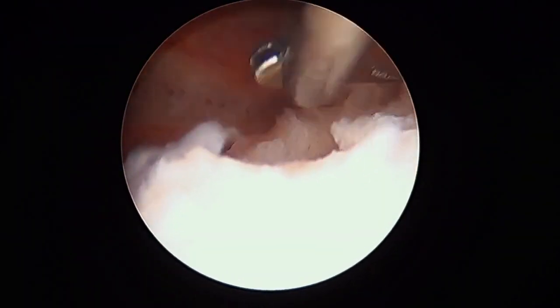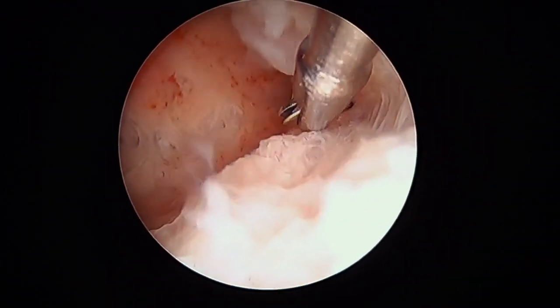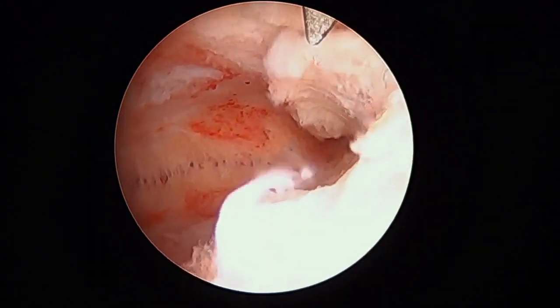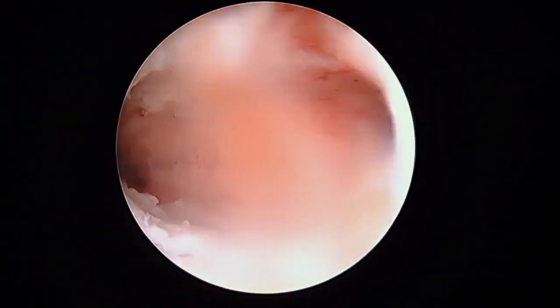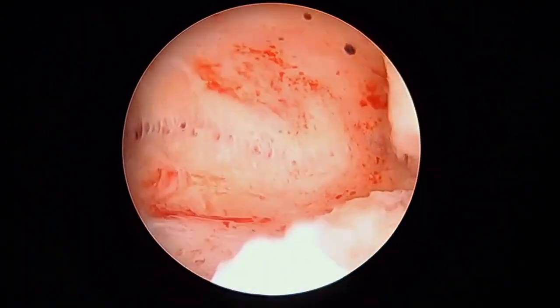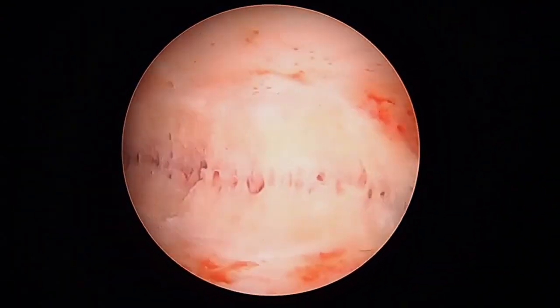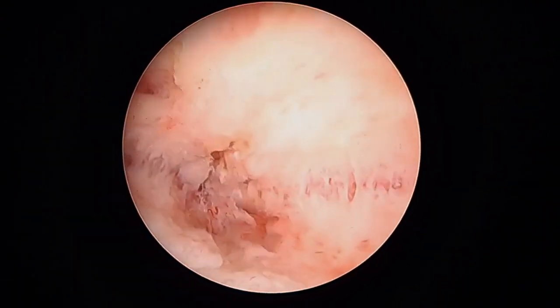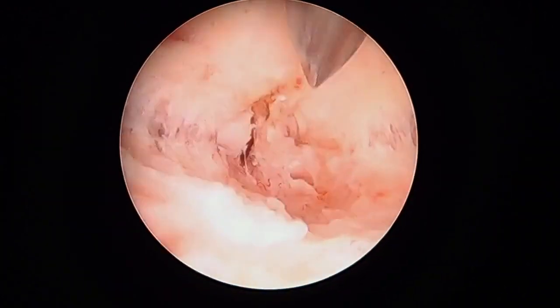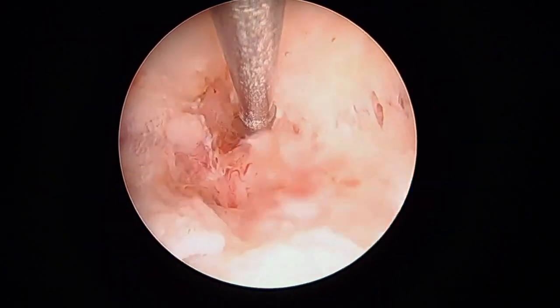Slowly and gradually, we make our way towards the corneum, as can be noted here. At the end of the case, the anatomy of the endometrial cavity is restored with both tubal ostia visualized in the same field.